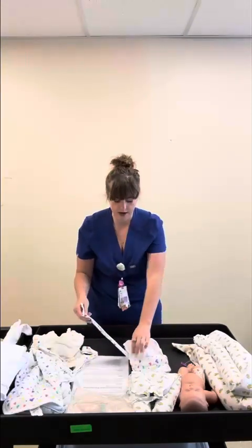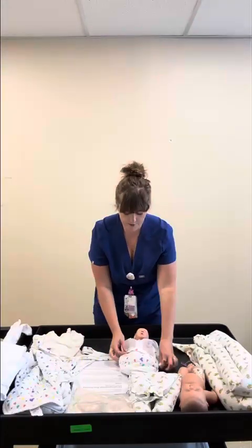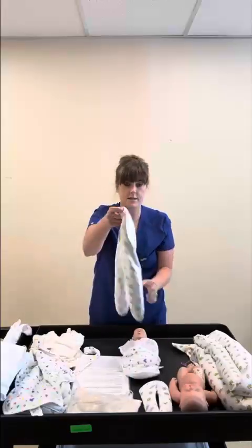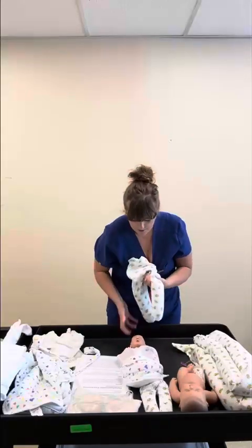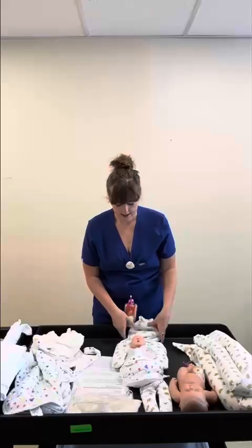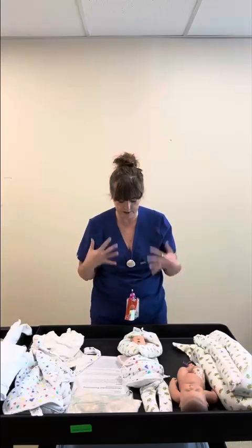And then these straps, you're not really going to use that much on phototherapy, but you can create over the diaper area, since that's covered anyway, a little strap there, and maybe combine the second strap over there. And then you're welcome to utilize the bean bags for that 360-degree barrier. Babies want 360 degrees of proprioception, like they're in the womb and feeling their walls. Just make sure you're not laying the beanbag on top of the baby's chest in any capacity, because it's heavy and can impede their respirations.